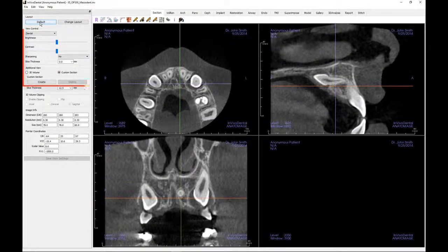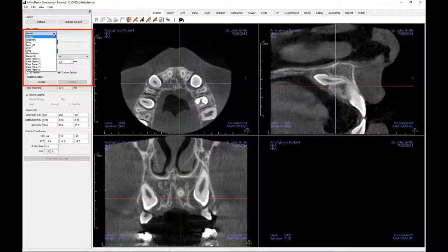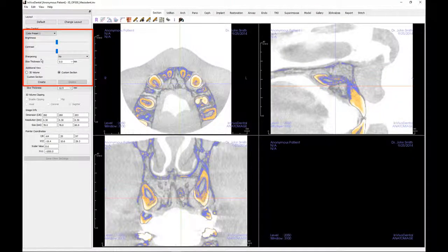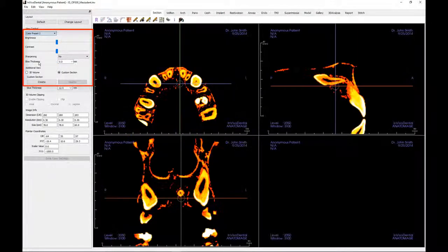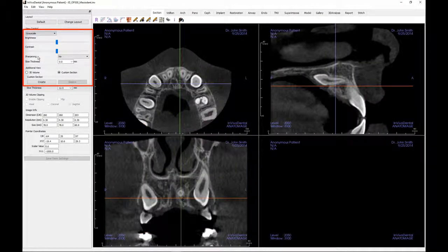Let's shift our attention to the functions available within the control panel. The view controls should be set to dental. As needed, color presets may be used to better visualize certain anatomic structures, soft tissue profiles, airway, etc. The color rendering is only for visualizations. The colors are based on densities but do not represent the density value of bone.